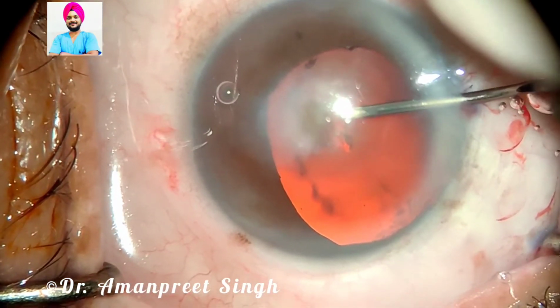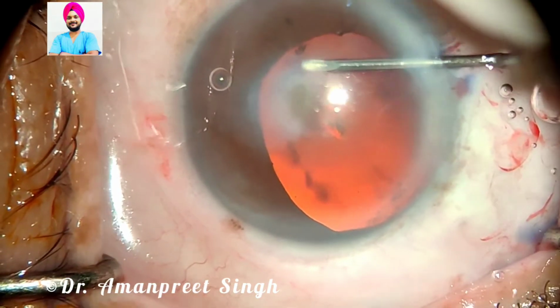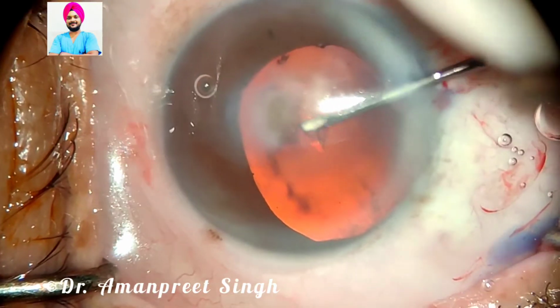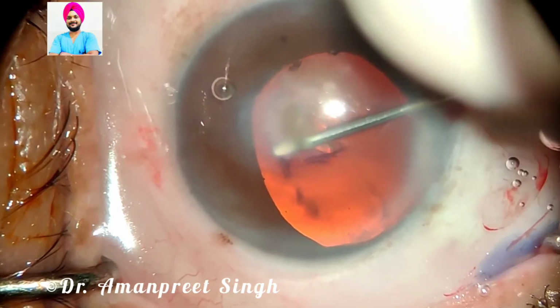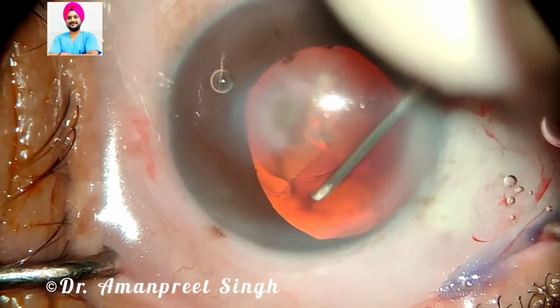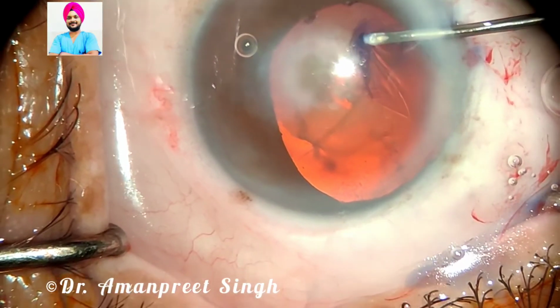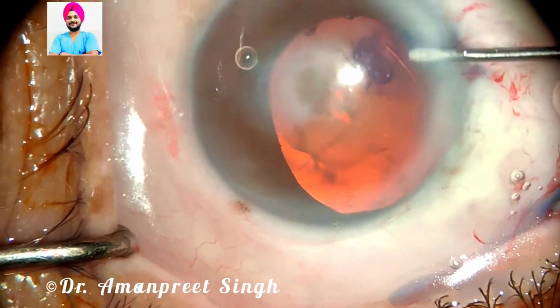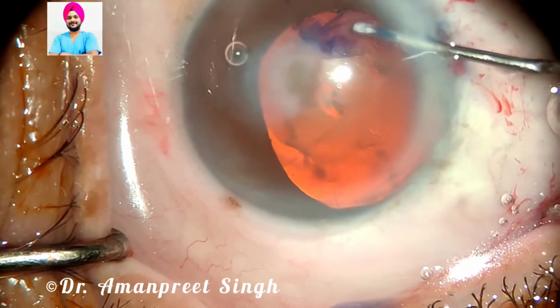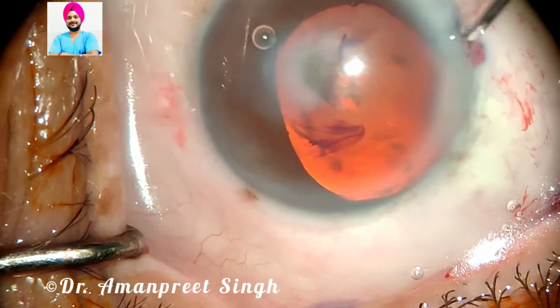I have raised the flap and I am proceeding with the capsular access. I had a difficulty in doing rexis in the zone where the corneal opacity is there, but I was able to complete the capsular access. So I planned a little bit bigger capsular access. So with this step we have completed the capsular access.